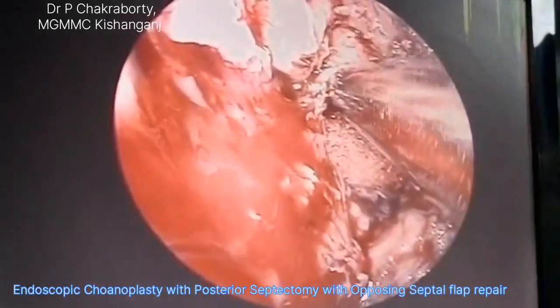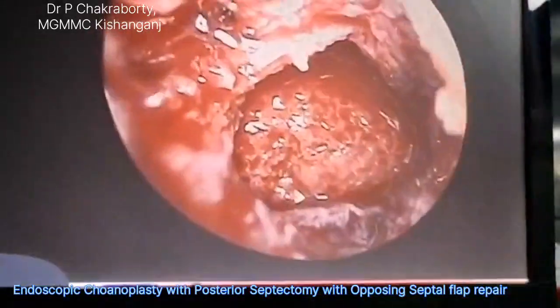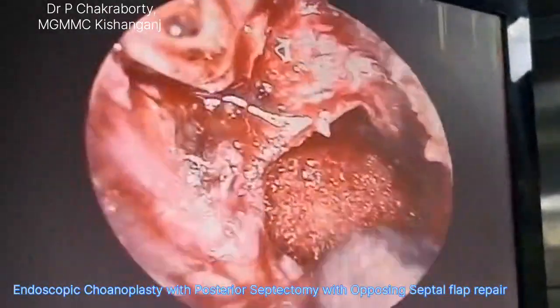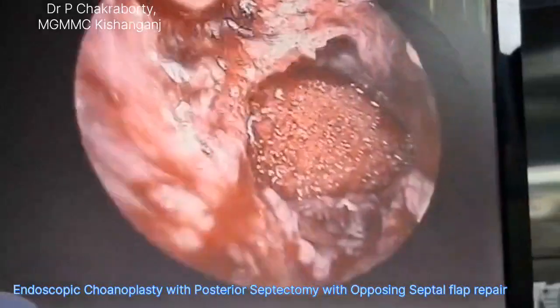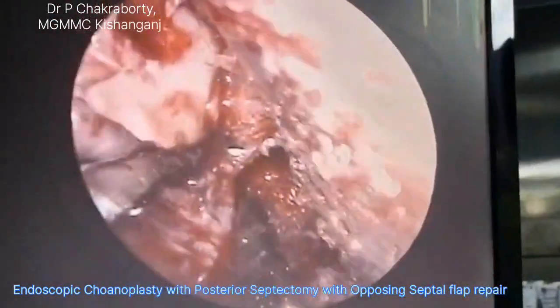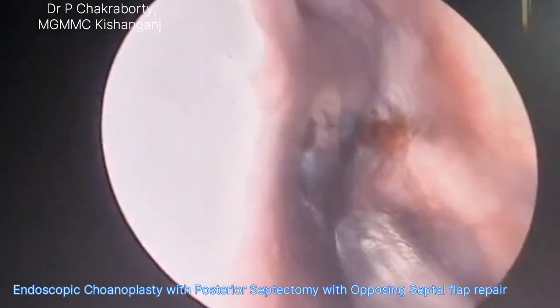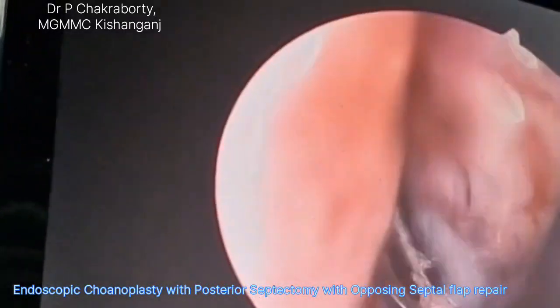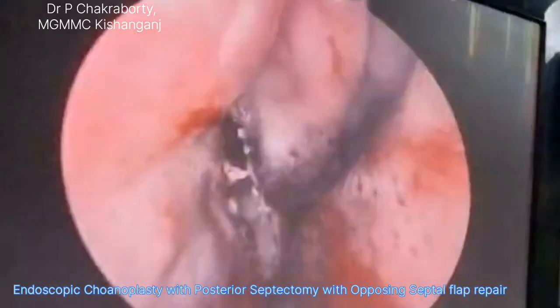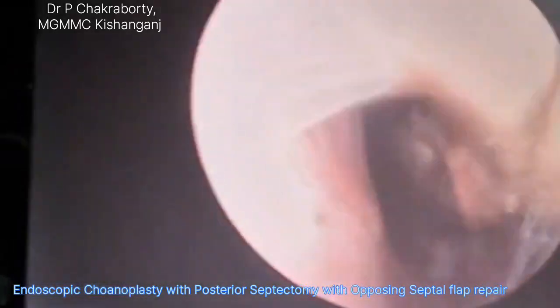So as you can see we have opened up the atretic membranous segment, and we can see the portion of the nasopharynx with the pack inside. So now we have opened up the atretic segment. We are also trying to remove the remnant of the atretic area using a bipolar cautery. So we have removed the atretic segment from both the sides, and we are also taking out the septum from its posterior end.